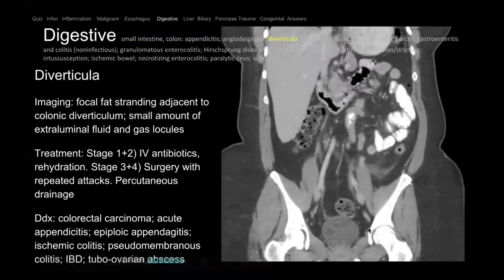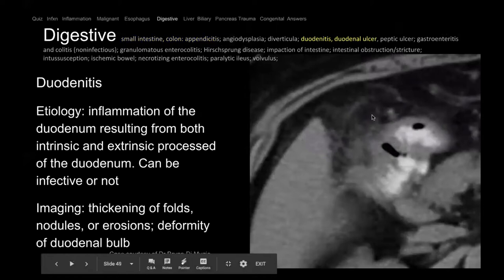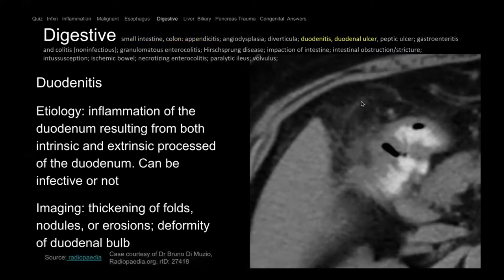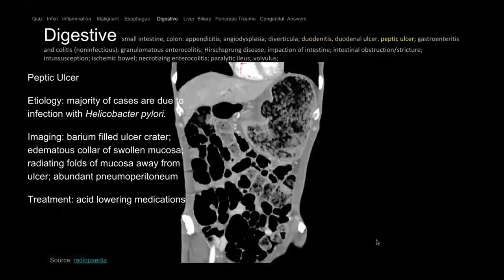Here's a very zoomed-in view of the duodenum. This is the liver, pancreas, and duodenum. There's thickening of the duodenum and fat stranding. This is duodenitis — inflammation — which can be from ulcers, trauma, or post-ERCP complications where the duodenum is accidentally perforated. You want to look for free air to make sure there's no perforation, because that requires surgical correction.